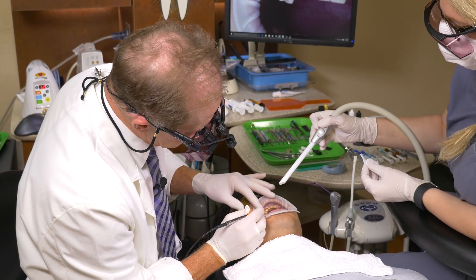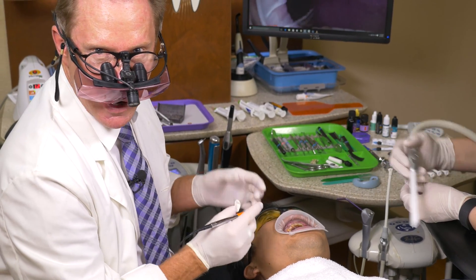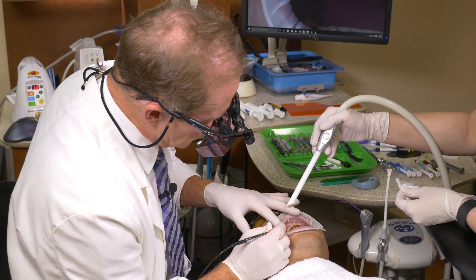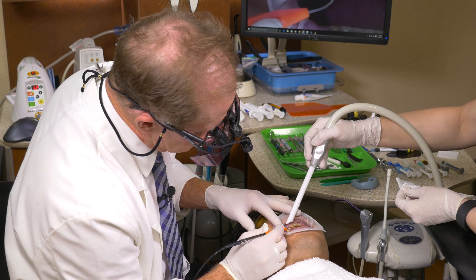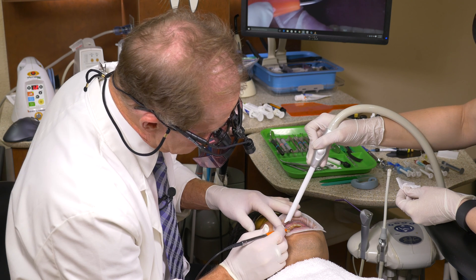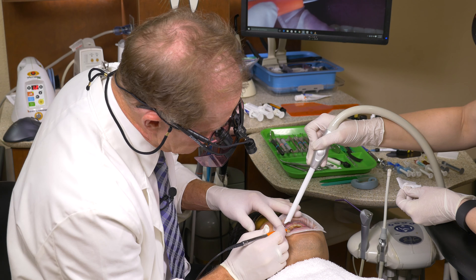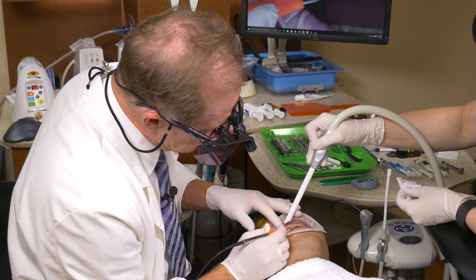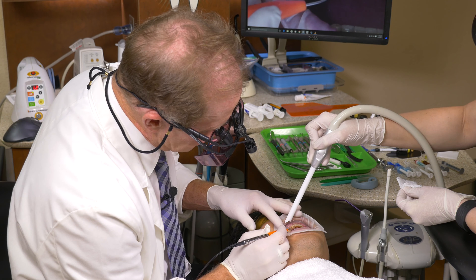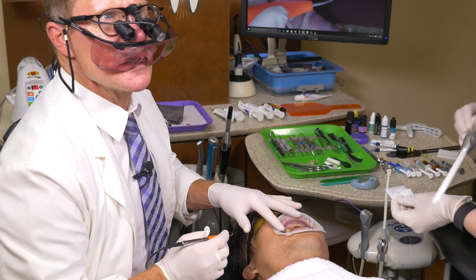Let me know if you have any discomfort at all. Our goal with this — I want to envision exactly where that tooth would be exiting the tissue. I'm very visual; I like to imagine I just extracted that tooth: where would the hole be, and what would the diameter be? It's not going to be facial — it's going to be in the center of the ridge. So what I'm doing here is outlining the pontic itself. Keep in mind the diameter that root would be.